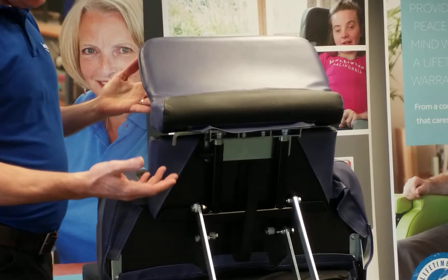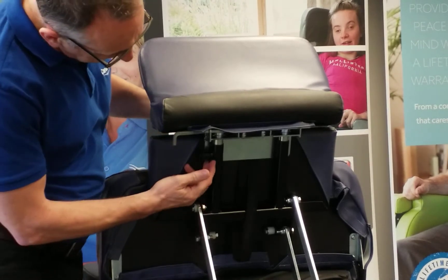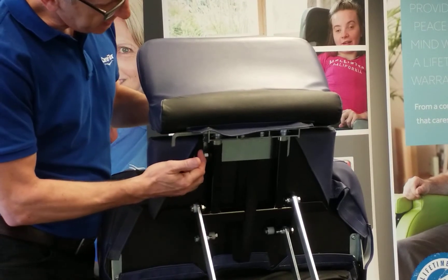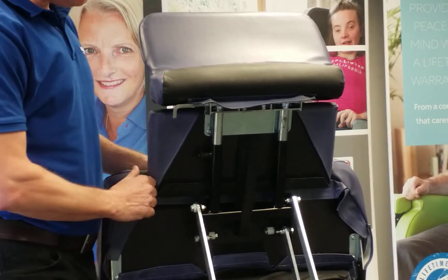If I have a client with longer legs I may need to increase the length of the footplate or leg rest. Pull the plunger towards you, adjust, release and that will lock in place.